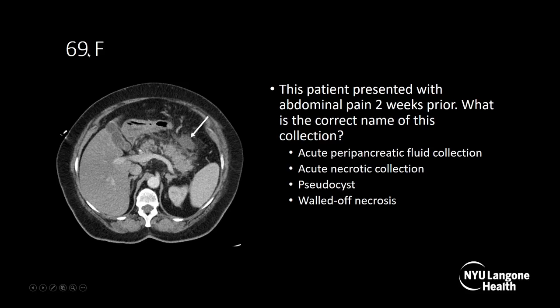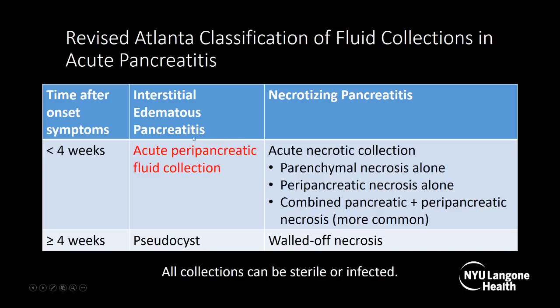Here's another example. This is a 69-year-old female with an axial CT with IV contrast. There is a simple fluid collection — just fluid, nothing in it. This patient presented with abdominal pain two weeks prior. So the correct name of this collection is an acute peripancreatic fluid collection. That falls under less than four weeks after symptom onset with interstitial edematous pancreatitis — no necrosis.